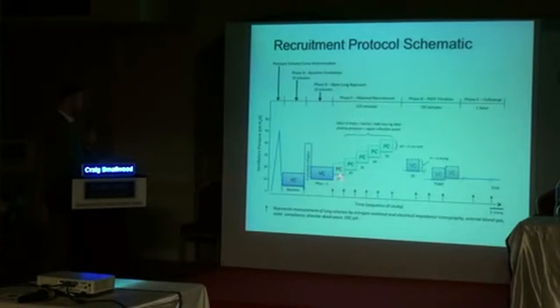So we started on a PEEP of 15 centimeters of water, and then every 5 minutes, we increased by 5 centimeters of water up to a maximum of a PEEP of 35, which meant 50 over 35. And the amount of time on each of these intervals is 5 total minutes. And after every 5 minutes, we collected an EIT image as well as a blood gas, and we looked for maximum lung opening by a combination of PaO2 plus PaCO2 of greater than 400.